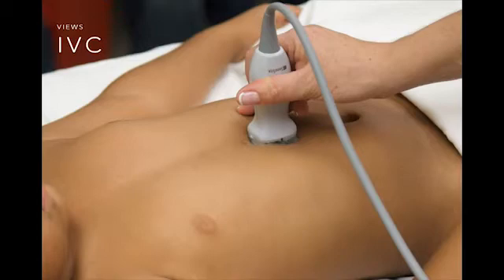You can use a phased array. It's best to find the IVC in transverse or cross-section and then rotate with the indicator towards the head. But make sure that you maintain the probe perpendicular to the body and also at the midline. So you can use the umbilicus as your landmark. If you're off a little bit, you may be looking at the aorta, unfortunately. So make sure that you're really a stickler about maintaining that probe perpendicular and in the midline.